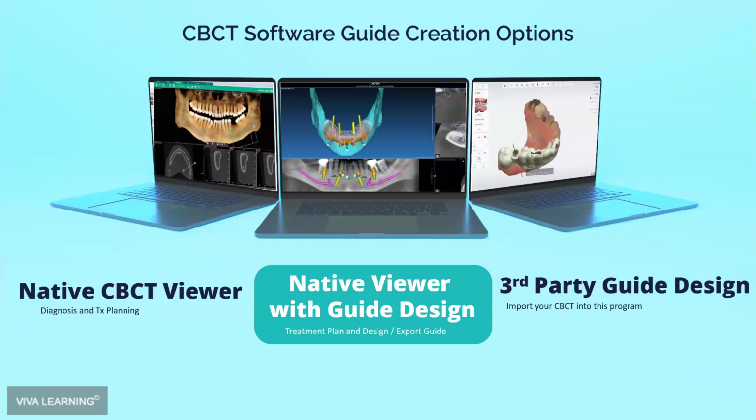You can have a native CBCT viewer, which simply comes with the machine. It allows you to view the scan. You can see the rendering. You can go through slices. You can diagnose and treatment plan. Maybe you can drop some implants in there.